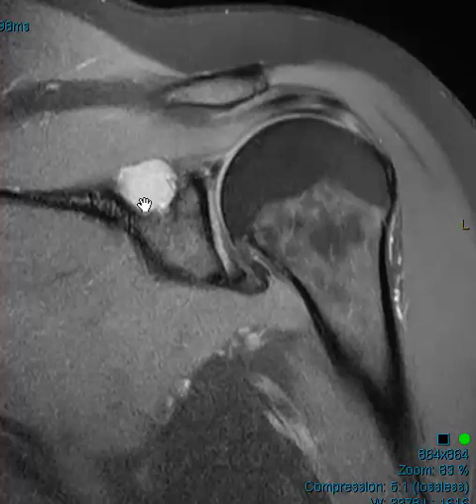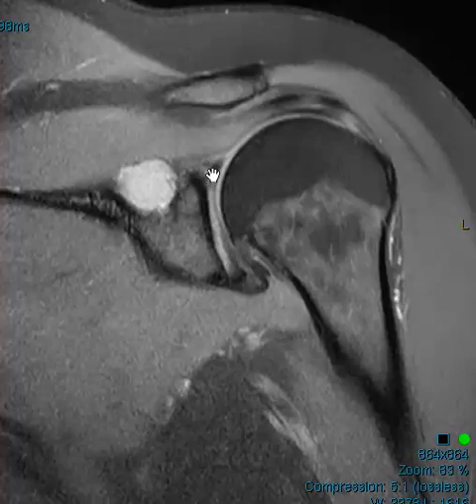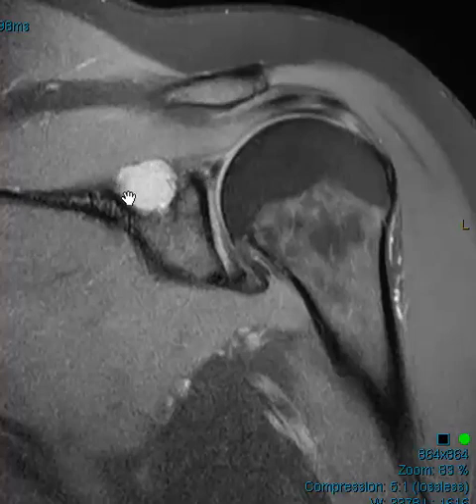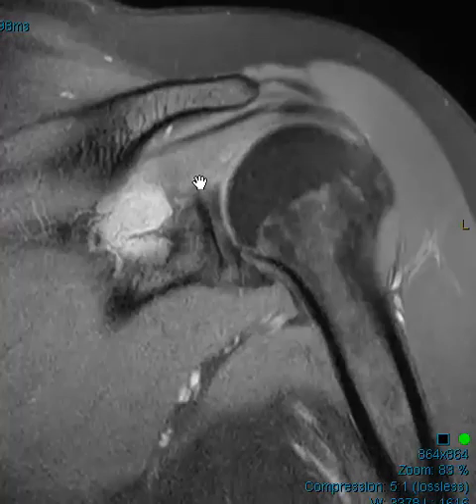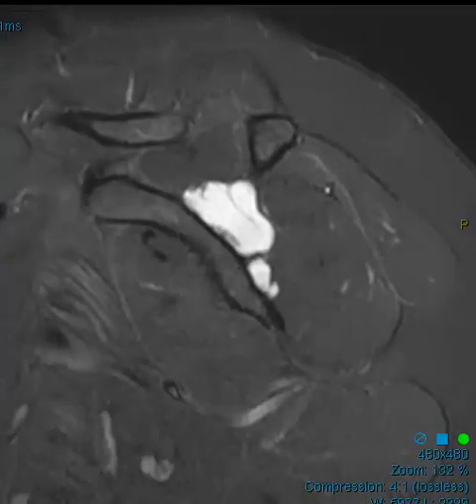I believe this is probably a very small tear of the posterior aspect of the superior labrum, probably serving as the etiology for this cyst — so probably a paralabral cyst. But this is one of those rare cases where you struggle: I don't see a clear communication, and it's not a hundred percent sure it's a labral tear, though it probably is. We have to hedge and say this is probably a paralabral cyst, probably coming from an occult labral tear that we don't see very well — maybe it's scarred down.